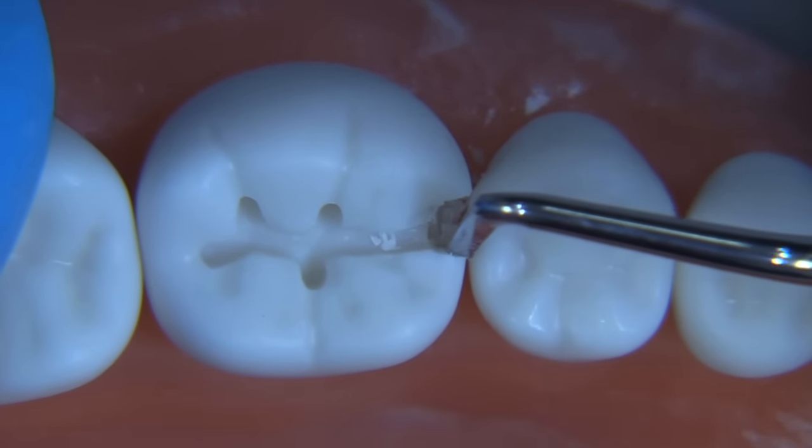The bur was made longer than the standard 330 on purpose so that it could smooth the entire wall — not just the minimal 1.5-millimeter areas but all areas of the preparation. At this point we're getting close, but the transition from the occlusal to the box isn't done yet — that's too aggressive of a transition. Now it's much smoother and nicer. We're using the hatchet to make any little refinements in the line angles and point angles. This would also be the time to place auxiliary retentive form if desired.